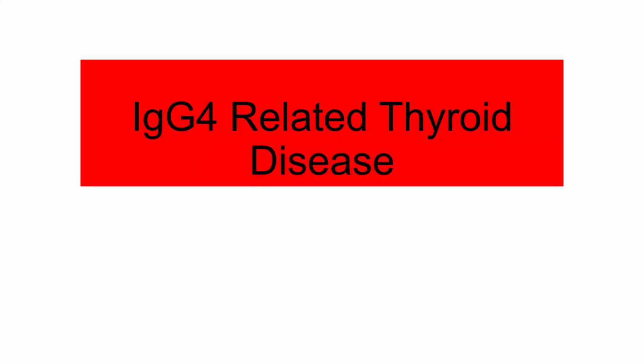So I think before you make a diagnosis of IgG4-related disease of the head and neck, one, consider Wegener's granulomatosis, and two, Wegener's granulomatosis can show a substantial increase in IgG4 positive plasma cells, again de-emphasizing the importance of the IgG4 stain. Okay, so just moving on to the thyroid a little bit.